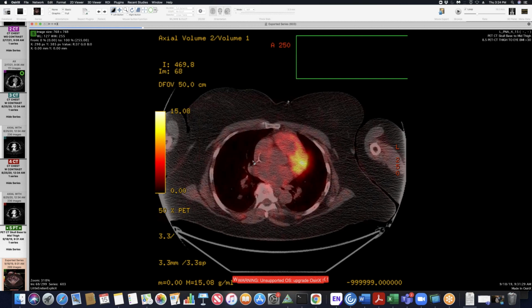So I think, if I remember correctly, Jeff, did you ever show a case of a legume or something that was really low in attenuation that was aspirated? Maybe I have a lot of aspirated things, or maybe it was David. Yeah, but I know we showed a peanut one. Yeah, it was a peanut from years ago, and it was really fatty, and it was lodged in an airway.